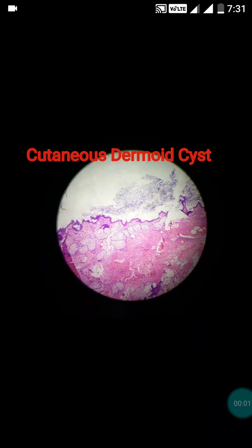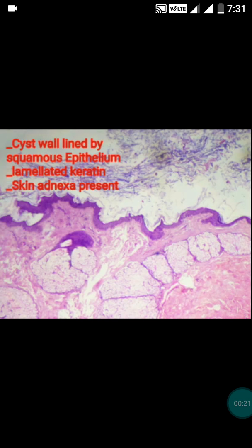Today I will teach you about the cutaneous dermoid cyst. This biopsy was received from a one-by-one centimeter swelling present over the eyelid from the ophthalmology department. Let's start the discussion of the cutaneous dermoid cyst. This is a low power view of the cutaneous dermoid cyst, and now we will inspect it in the 20x view.